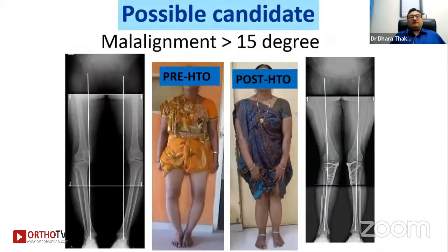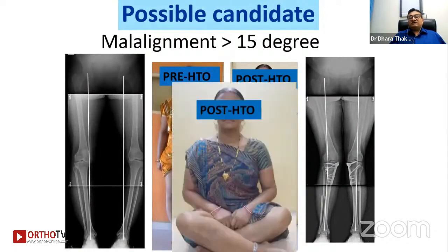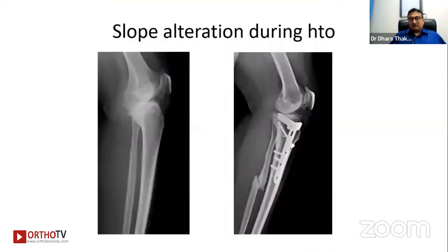If we see the pre-operative and post-operative X-ray, it is like this, and after doing both, she is able to sit cross-legged. So here, this posterior tibial slope was also corrected. Not only varus was corrected, here there was too much posterior tibial slope. It was brought to the normal.